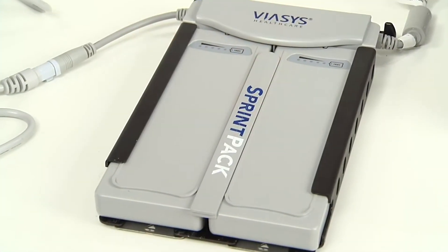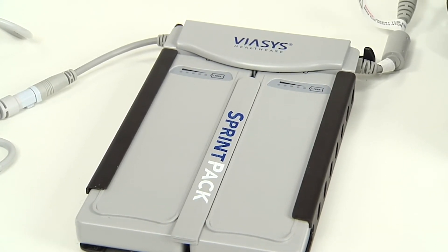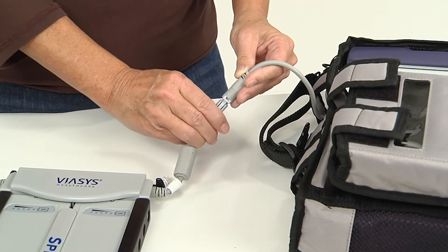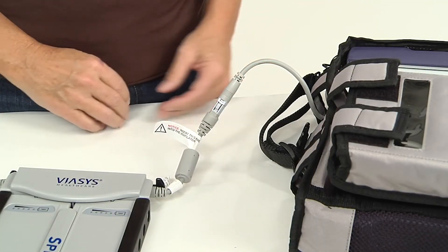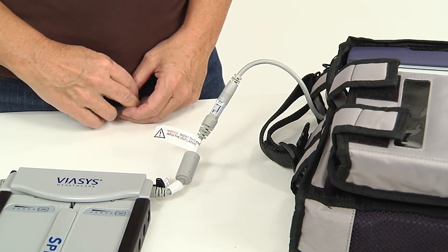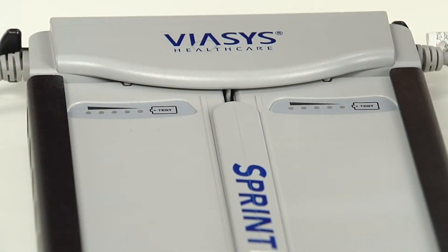The Sprint pack battery system will either power the ventilator directly or act as an uninterruptible power source if used in line with the AC power adapter. If you plug in the AC power to the Sprint pack and the Sprint pack to the LTV, the Sprint pack battery cells will recharge while the LTV is powered for patient use.